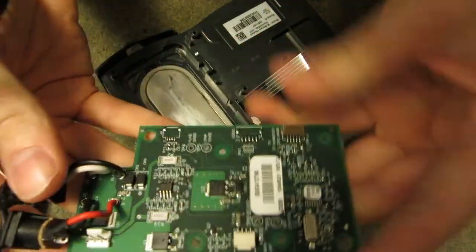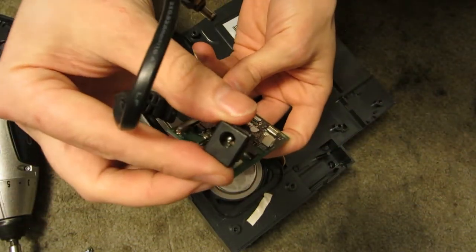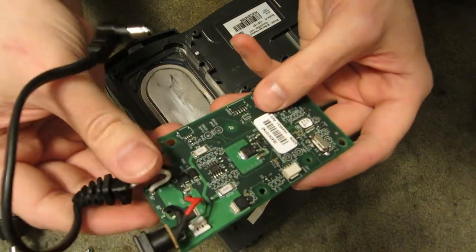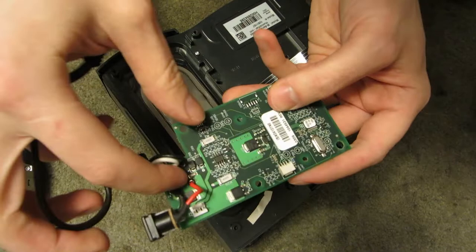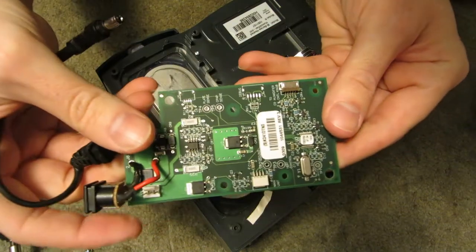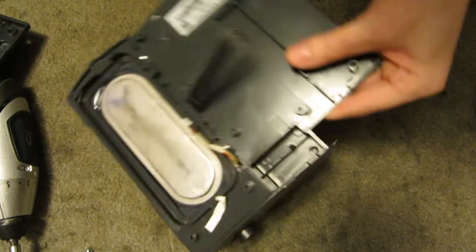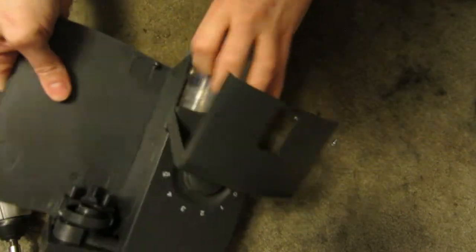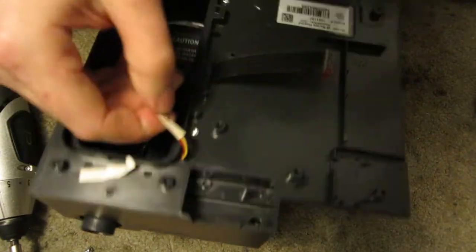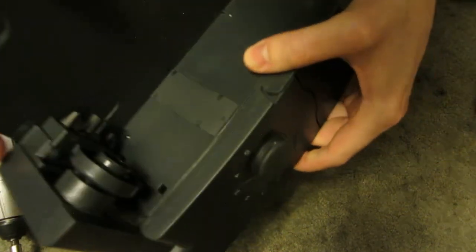And then you've got your little circuit board that controls that. This is actually where you hook up your power, assuming you have this whole assembly. And then this hooks into the actual blower assembly, so the power must just pass through here completely. These wires here just go right through there and must go up to your controller.